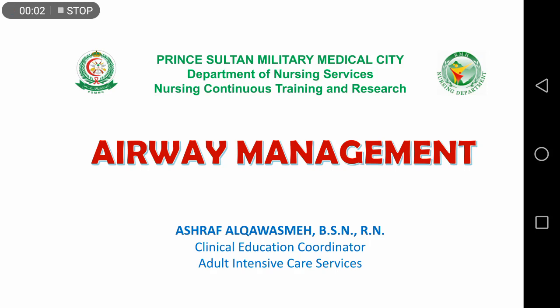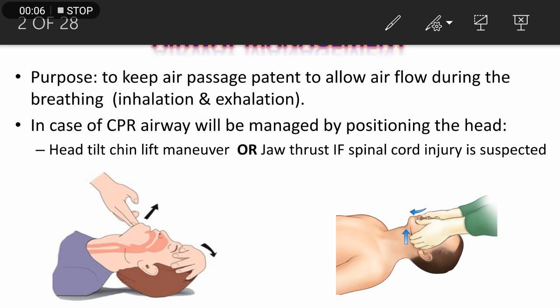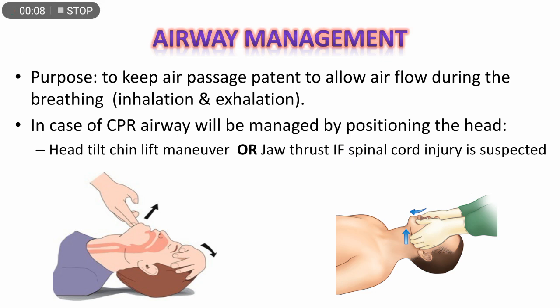In this session, we'll be discussing airway management. Airway management is one of the most important issues and procedures that we perform in the intensive care unit, and any patient who needs an artificial airway most probably will be in the intensive care unit. The purpose is to keep the air passage patent to allow airflow during breathing, whether it's inhalation or exhalation.